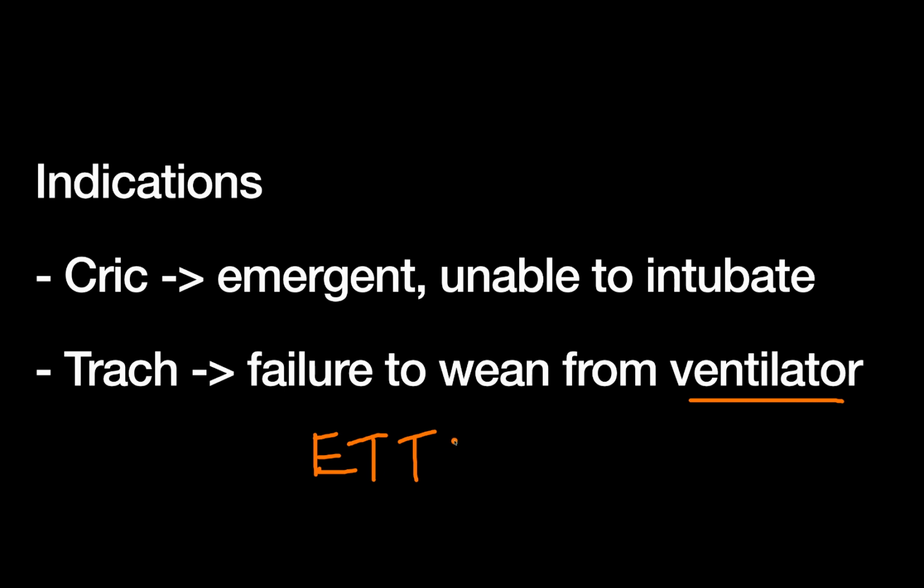And then it's also, if we think about just like with blood vessels, a long, narrow tube is hard to get anything through. And so an ET tube is a relatively long and narrow tube, and it's kind of like trying to breathe through a straw, which is very difficult and uncomfortable, as opposed to a trach tube, which is actually much shorter and fatter and easier for patients to move air through.